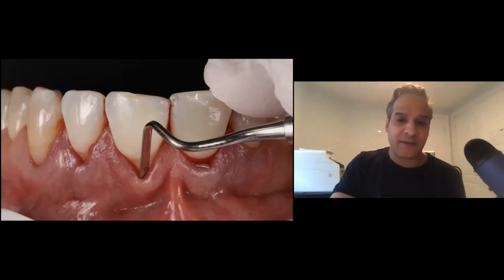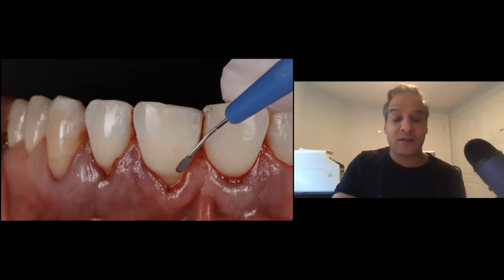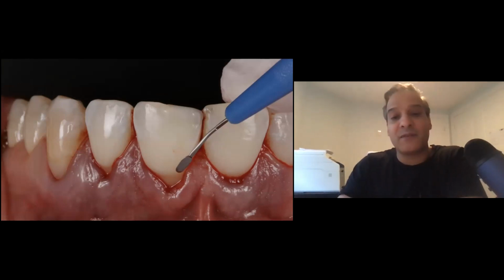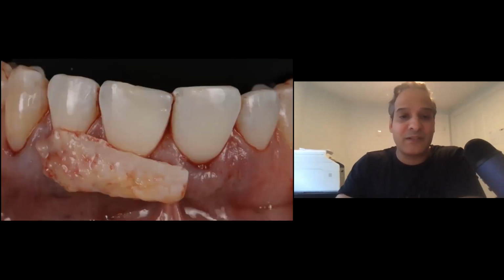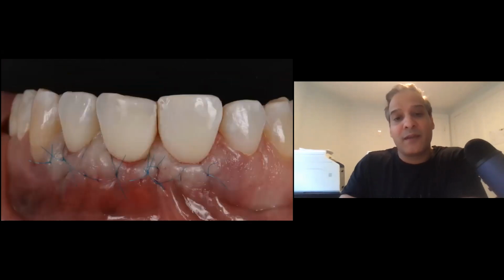The interdental knife is used to start our tunnel, along with our tunneling spoons. In some cases, I can also use this ophthalmic blade to go in and dissect out the flap underneath to make sure it's fully released. Our graft is done. These are, I think, 7/0 sutures actually. Our graft is tucked into the tunnel and sutured in place. Here you can see the sutures hold the graft where we want it to be. And then with little slings, the graft is coronally positioned with the flap.